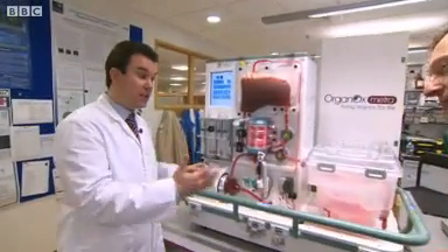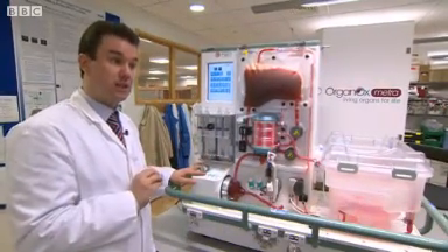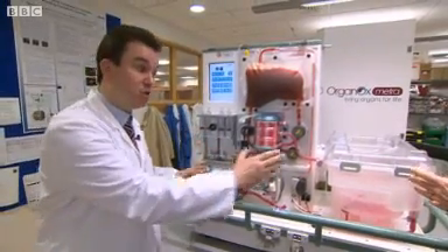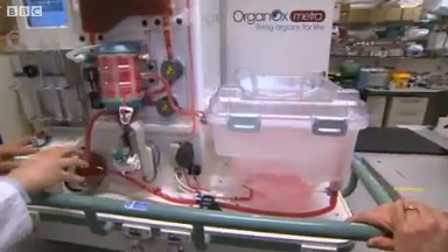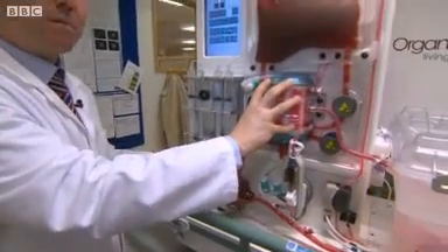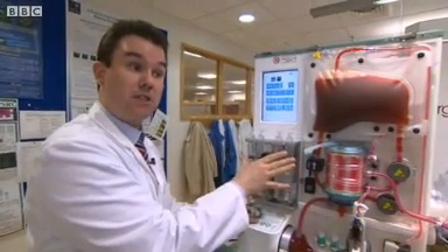This changes the paradigm for organ preservation. Organs are traditionally preserved cold in a refrigerated state. This effectively replicates the body environment at normal body temperature. The organ is placed here and we have a pump that replicates the function of the heart, an oxygenator that replicates the function of the lungs, and a series of infusions that provide the chemicals normally present within the body.